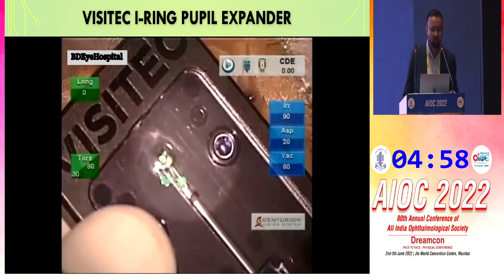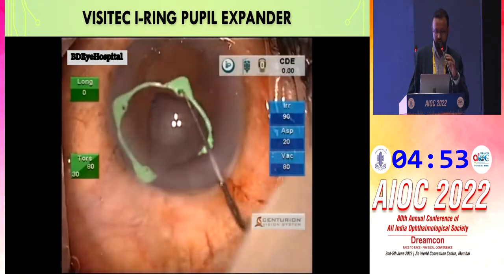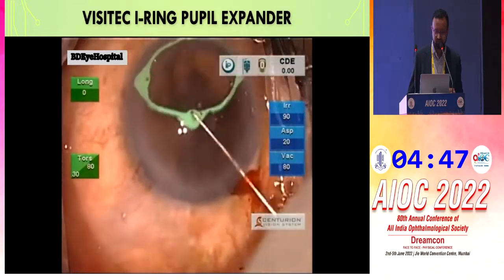And we can also use the Visitech iRing pupil expander. I took this video with the permission of our keynote speaker, Professor Nazrul Islam. This is also a good expander device and it helps us to do surgery.